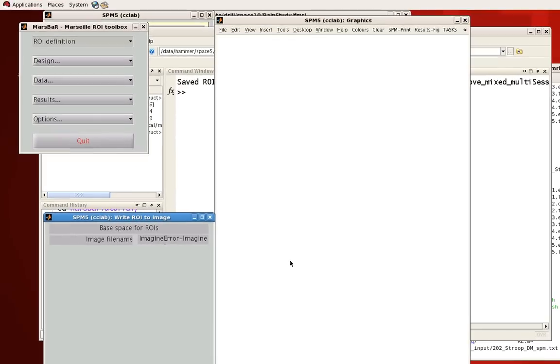So that's all there is to it. It's just like looking at your results from any SPM analysis. But you just select the coordinates of the cluster you want to write out to create a region of interest, only focusing on those voxels which are contained within that cluster.